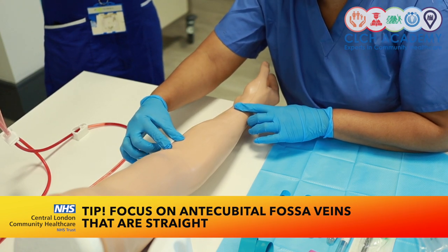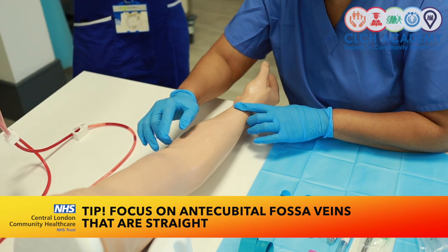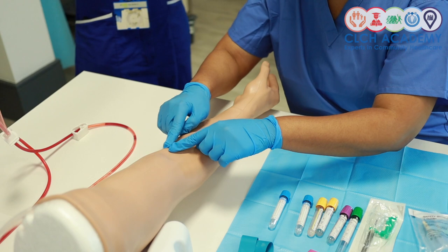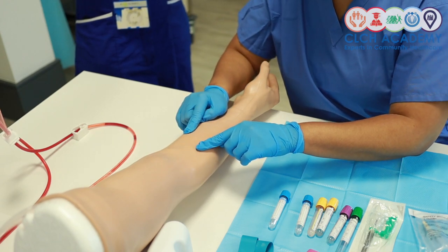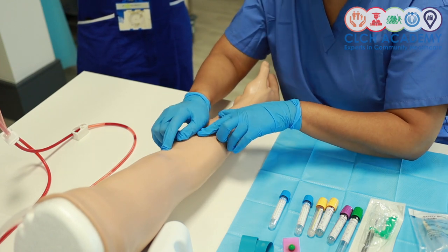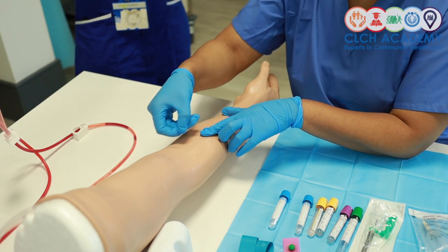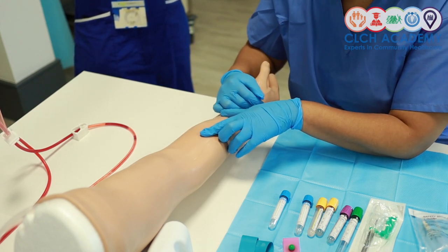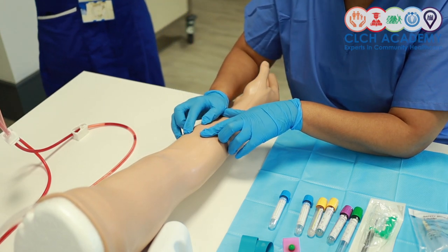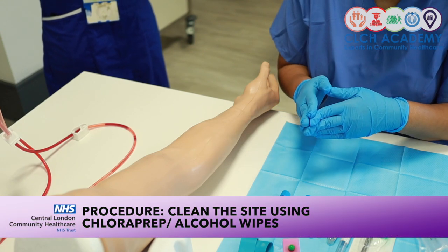You want to select a nice straight piece of vein because obviously you don't want to aim for a bifurcation. What is a bifurcation, you might ask? Where two veins split. Basically, you tend to get valves before a bifurcation, so always avoid a bifurcation because that provides resistance when you're inserting your needle. So I'm opting for this vein at this point in time. I'm happy with that. I'm now going to clean that vein.